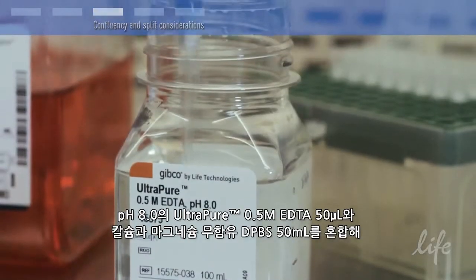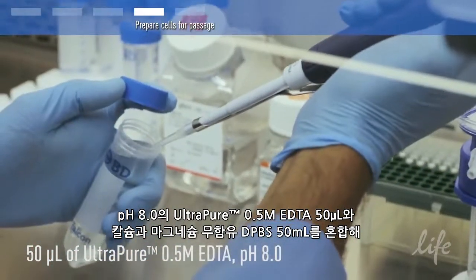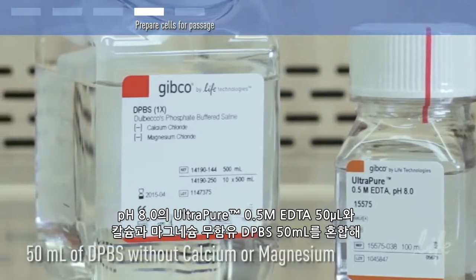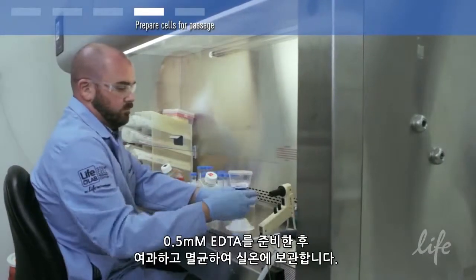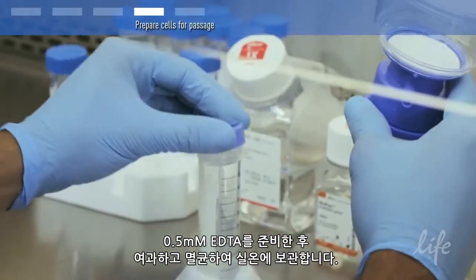Prepare 0.5 millimolar EDTA by combining 50 microlitres of ultra-pure 0.5 molar EDTA pH 8 with 50 millilitres of DPBS without calcium and magnesium. Filter sterilize the solution and store at room temperature.